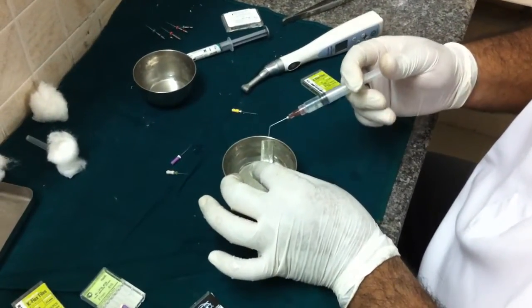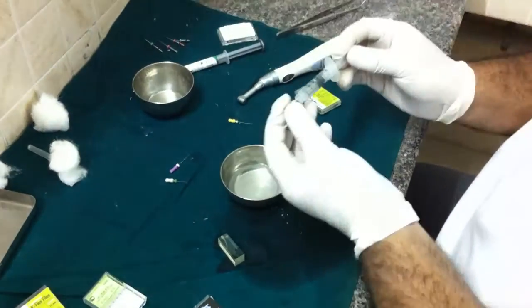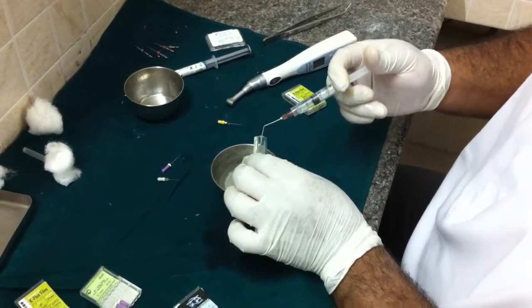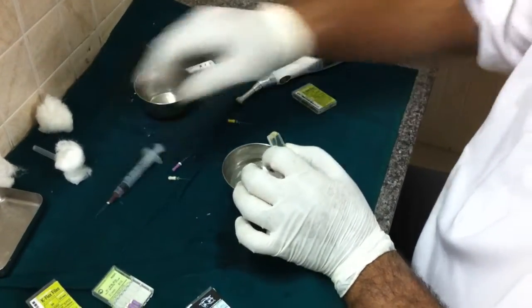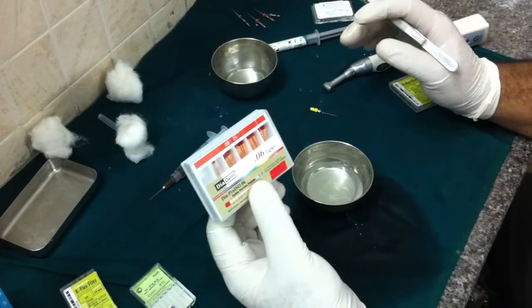Irrigate with saline. Copiously irrigate with saline. In the actual clinical scenario, you can use the appropriate irrigant, whether it is going to be sodium hypochlorite or chlorhexidine gluconate.